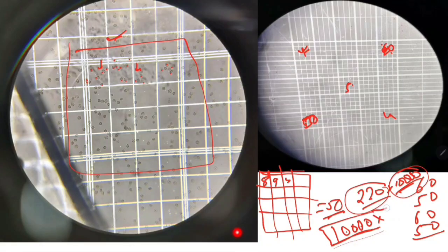But with this 10,000 you must remember one thing. Why I told you that the middle line is the reference line, and this is so important to count each and every cell. If you are counting one extra cell, it means you are counting 10,000 extra cells, because after counting you have to multiply it by 10,000. So if you are counting one extra cell, you are multiplying the final number.